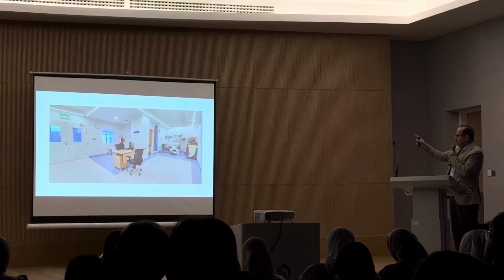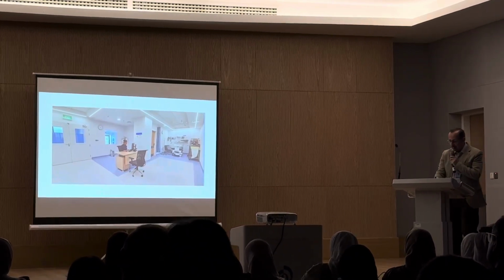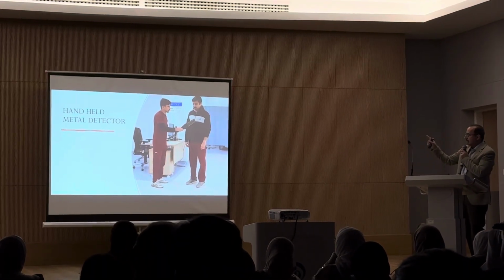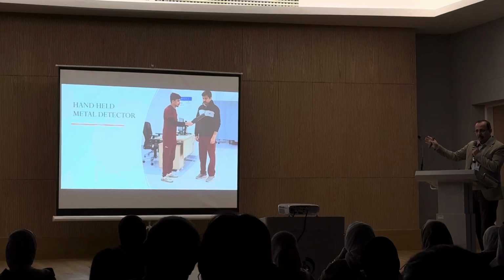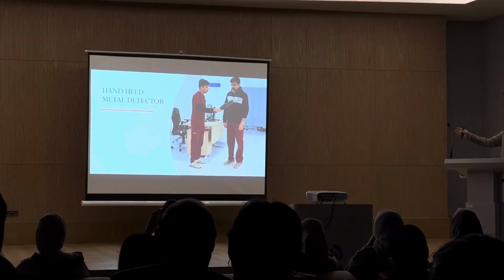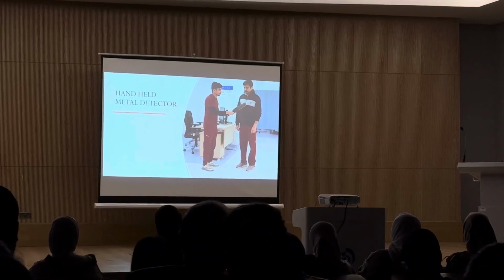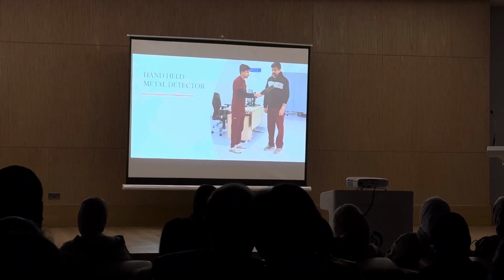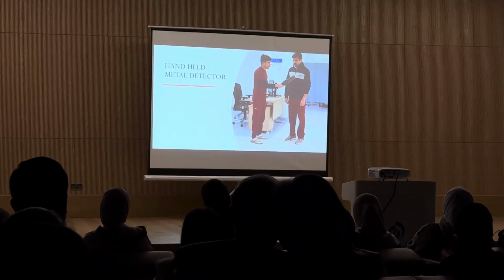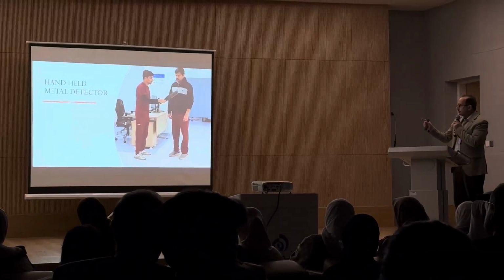In this area, we have the recovery room, and we have the desk for signing and taking the history. Also, in this area, we perform our handheld metal detector check. After the patient changes his clothes in the changing room, he comes, a full questionnaire is done, and the patient should read it carefully, and he should sign yes or no for every item on the questionnaire. And by filling this, the patient himself and the radiographer will sign on the form.